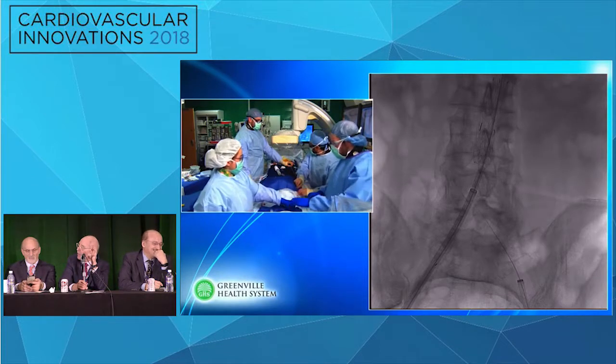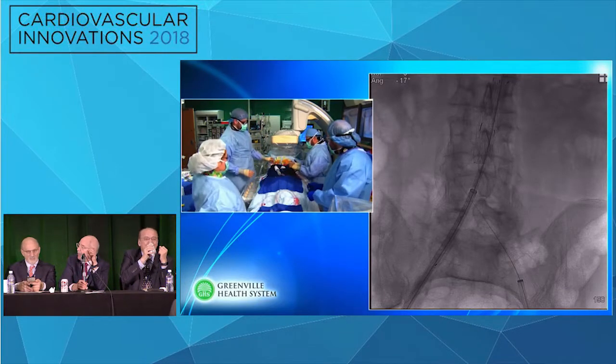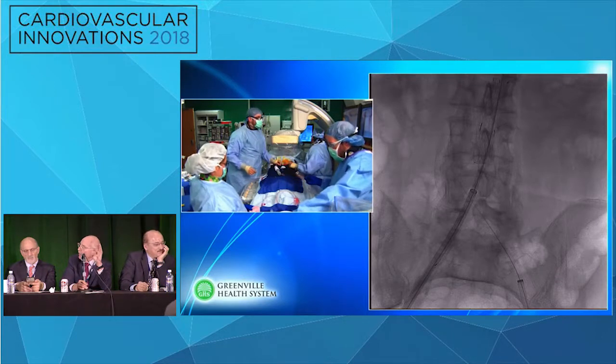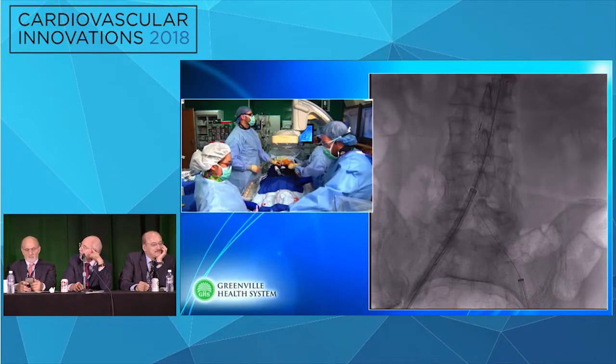Frequently it's a scramble. You get in access, you're trying to get a balloon up, you don't have time to do a pre-close, you're futzing around. And that's a situation where if you have to cut down afterward, it's a total pain. You're often too low, you get the lymphatics, I mean, it's a problem. So the MANTA device in that setting may very well be helpful.